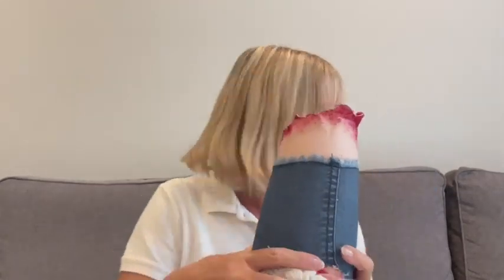So a trauma dressing is like one of the standard dressings that you might be used to in a first aid kit, but it is thicker, it is stronger, it will have a bigger pad, and it will have stretch to it to enable you to put traction on and apply the pressure you need to stop the bleeding. So one like this sort of trauma dressing will have a nice neat pad on.